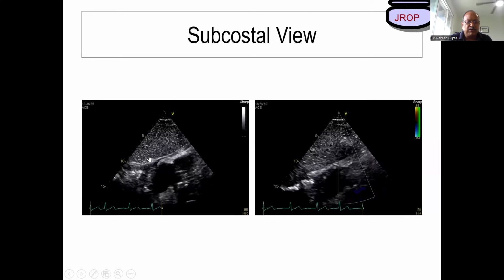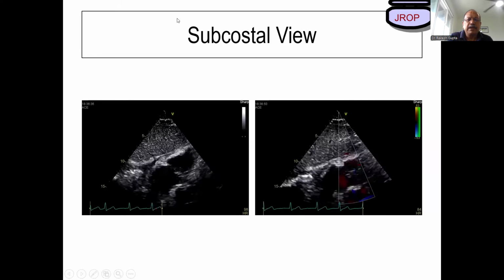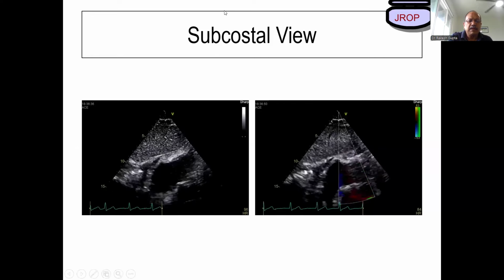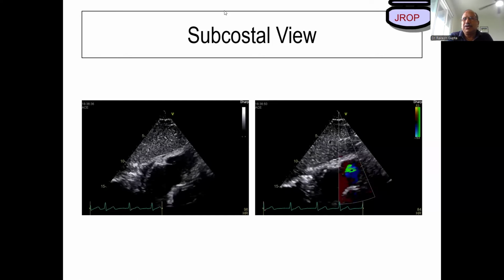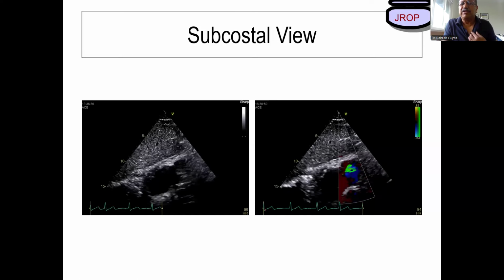Anything else, Dr. Mahatre? No, sir. All right. Sir, last time I had asked, I'm not able to get the aorta in the suprasternal view. I tried many times, even with neck extension, still I'm not able to get those views. Yes, you asked me this question. Let me show you how to get the aorta and the suprasternal window.